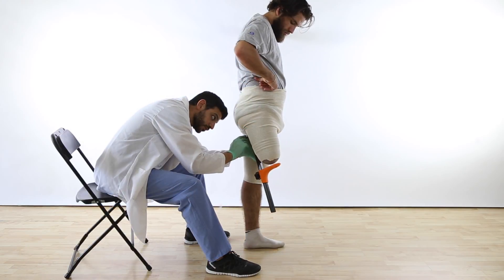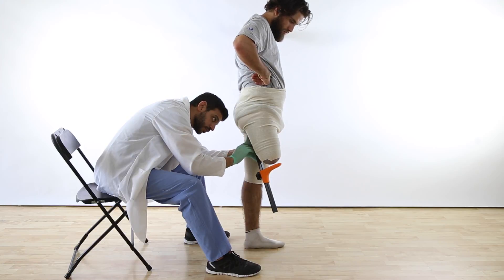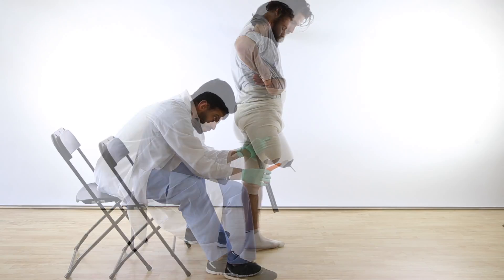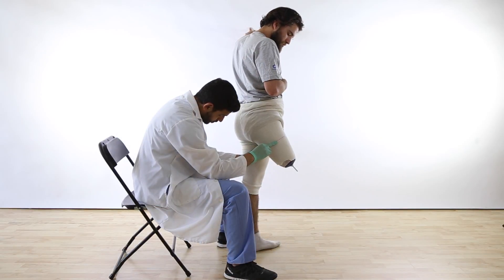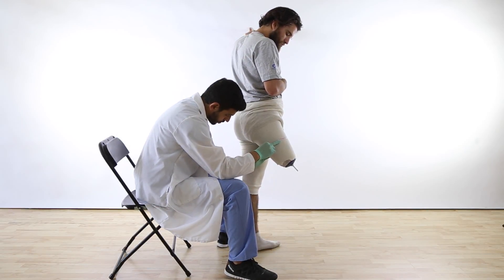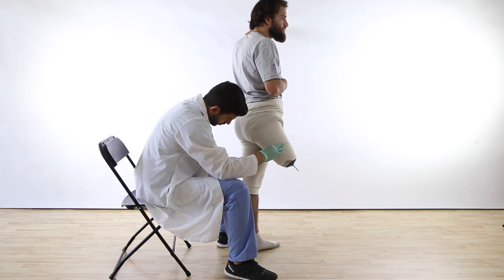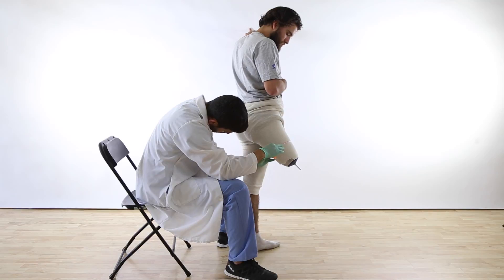Once length measurements are taken, place your limb length gauge on the patient again. Mark every 25 mm interval distal to the ischium and take your circumference measurements at each of these intervals. You will take two sets of circumference measurements — one tight and one relaxed — and record both sets on the measurement form.